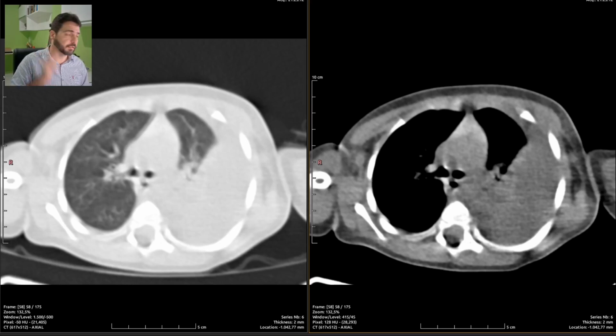So feel free to skip ahead if you want, or just stay with me as I report this case so you might actually learn a bit more about it.